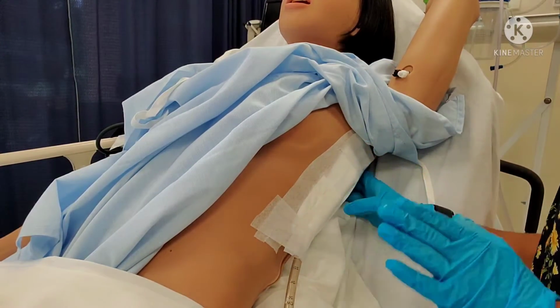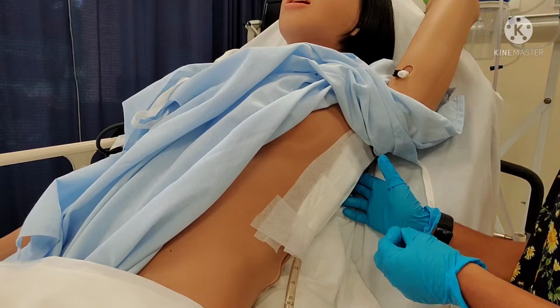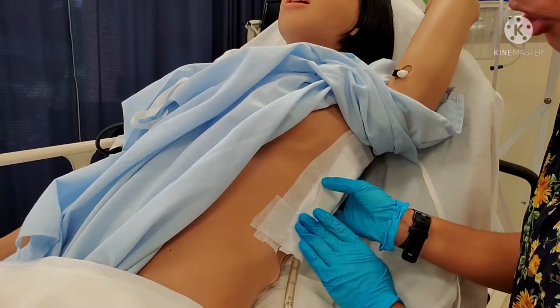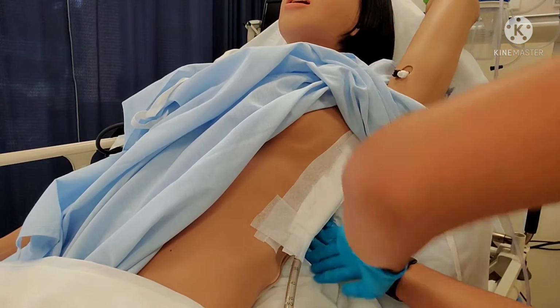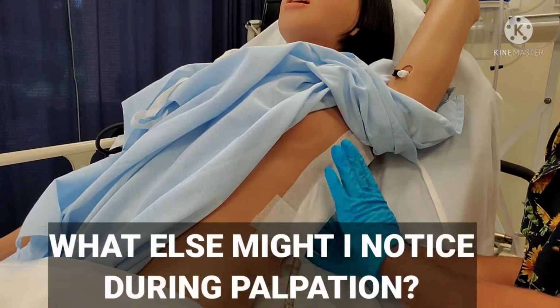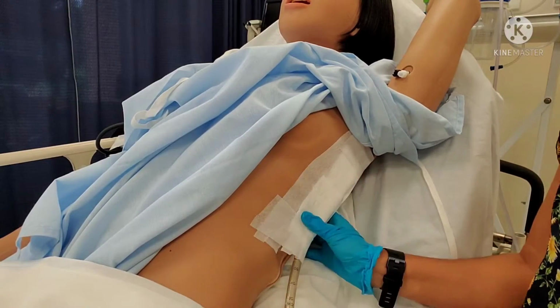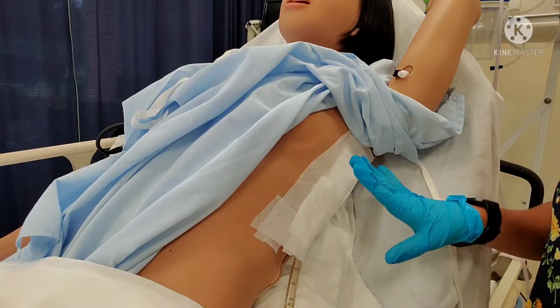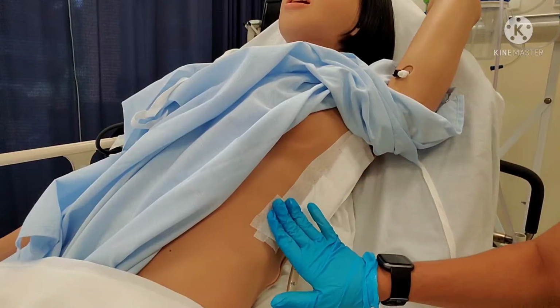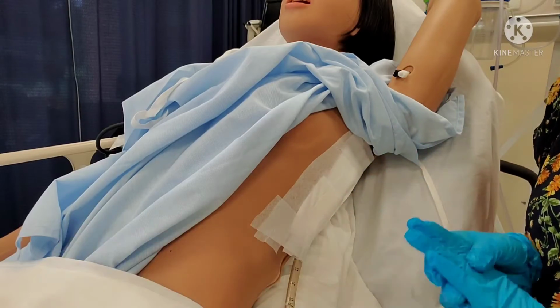The main thing I want you to know here is that this dressing should be dry and intact. Does it look dry and intact to you? It looks dry and intact to me. And when I feel the dressing, I want to make sure that I'm looking at the entire dressing. If I need to have the patient turn so I can see the back of the dressing, I will, because I want to make sure that this dressing is tightly sealed, okay? That helps to make sure that my chest tube stays in place where I want it to be, but also helps with air leaks, okay? I'm sure you've learned a lot about air leaks and how we don't like them when we have chest tubes. So I want to make sure this dressing is intact.